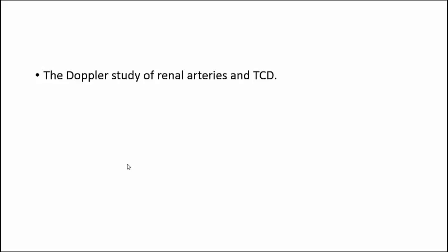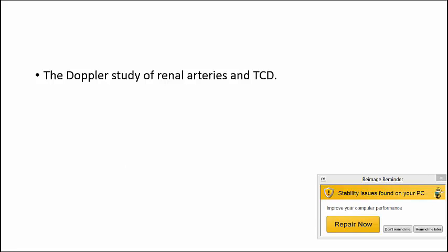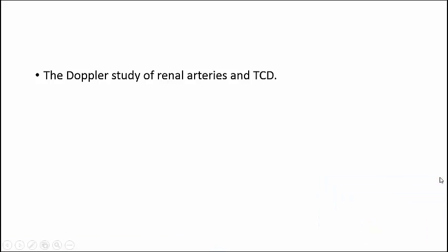The Doppler study of renal arteries and TCD. And we can include other vascular beds later on. But the renal vascular bed and transcranial Doppler are very important in management of the shock patient. Let us see. Back to our patient.